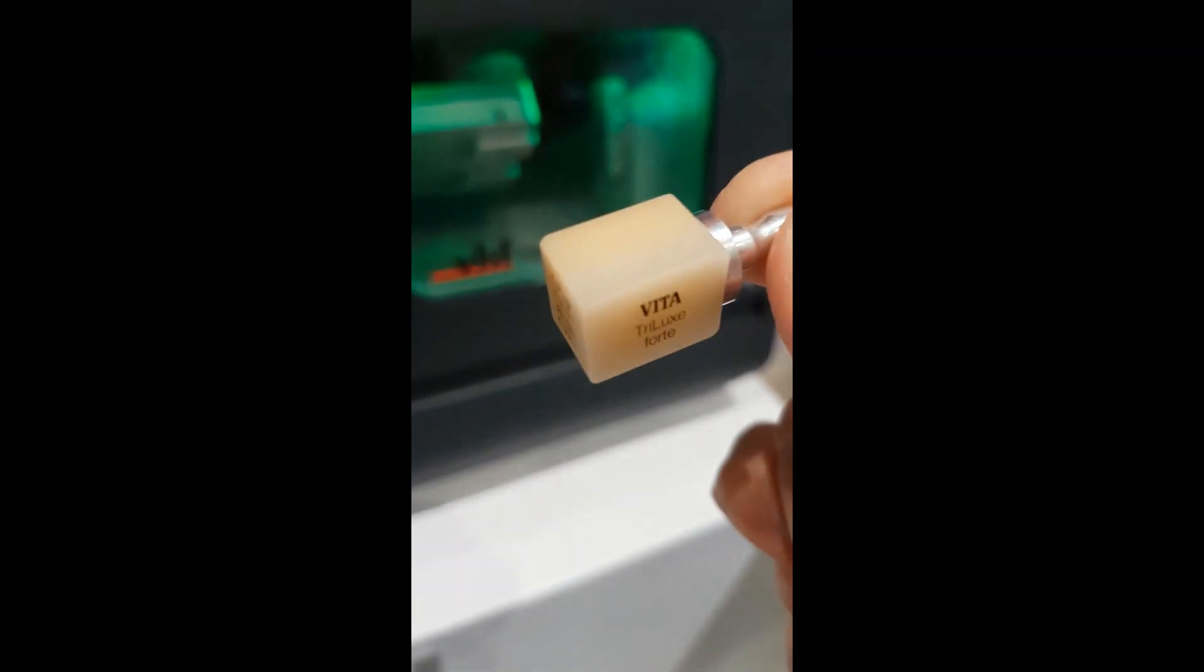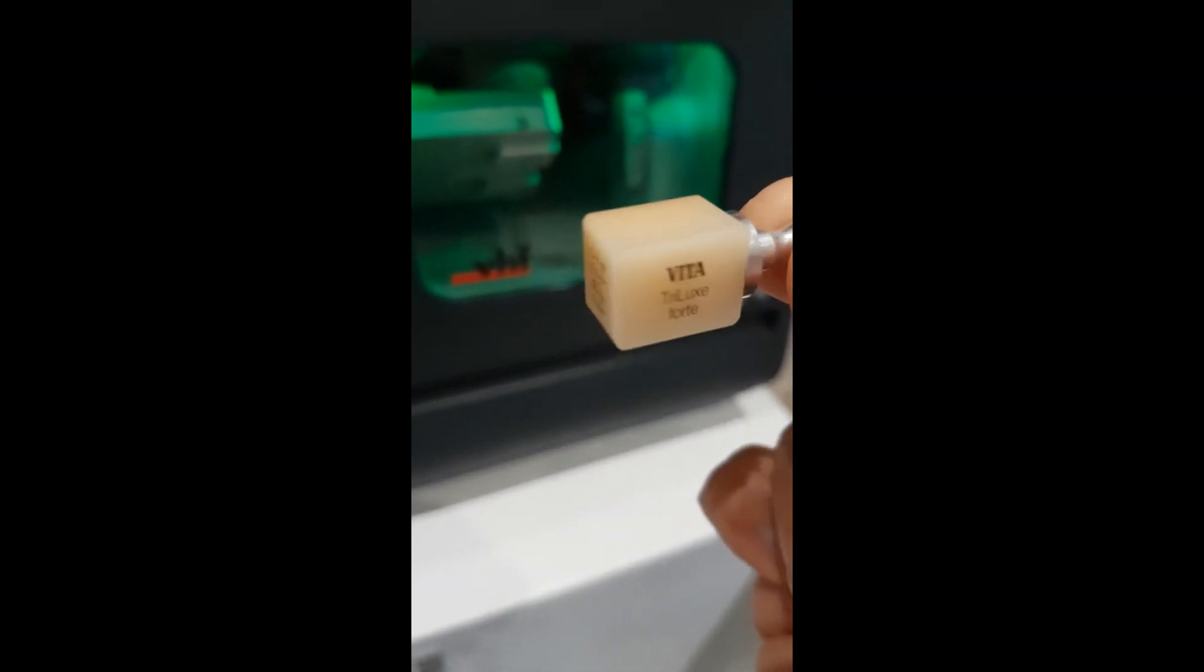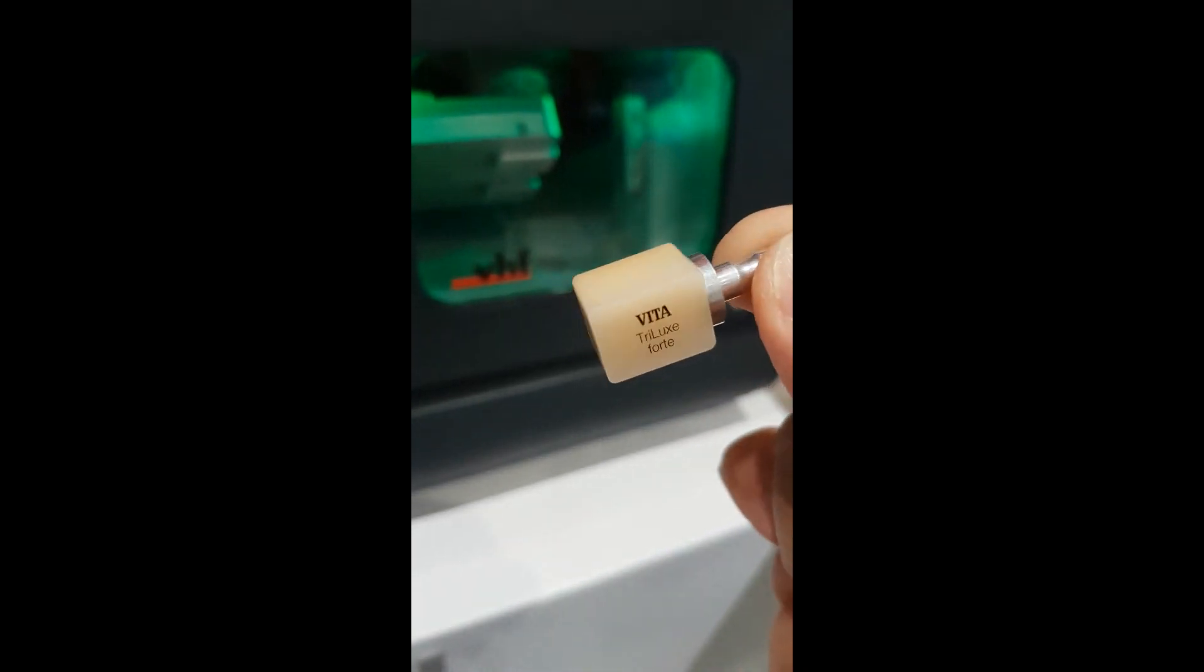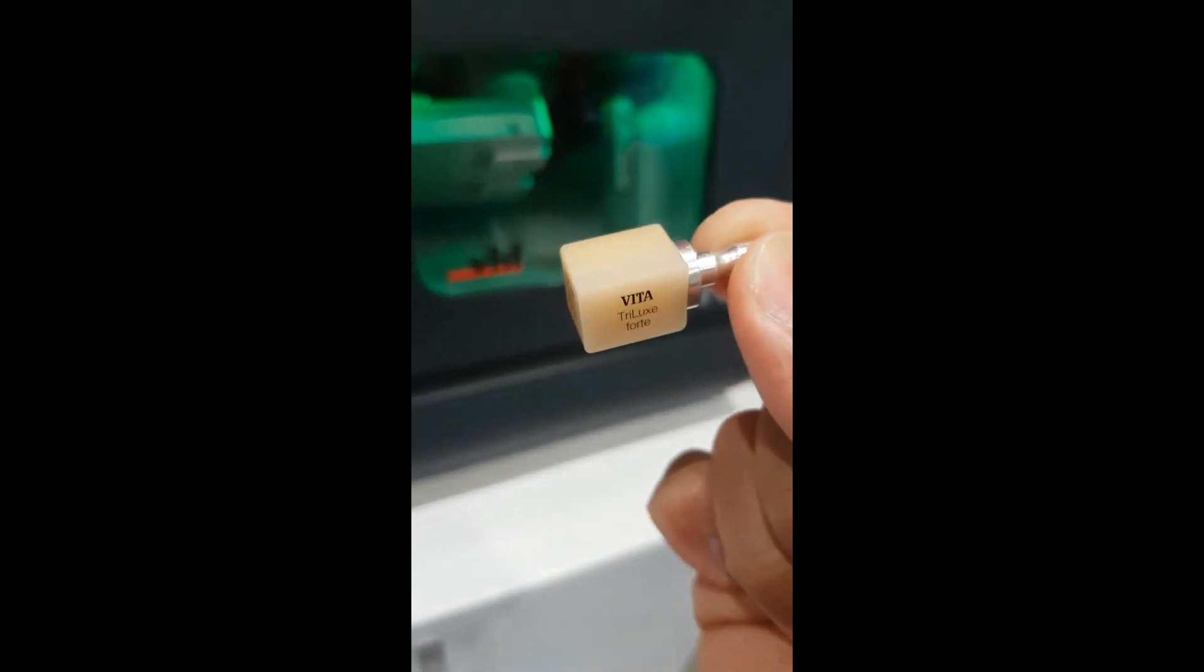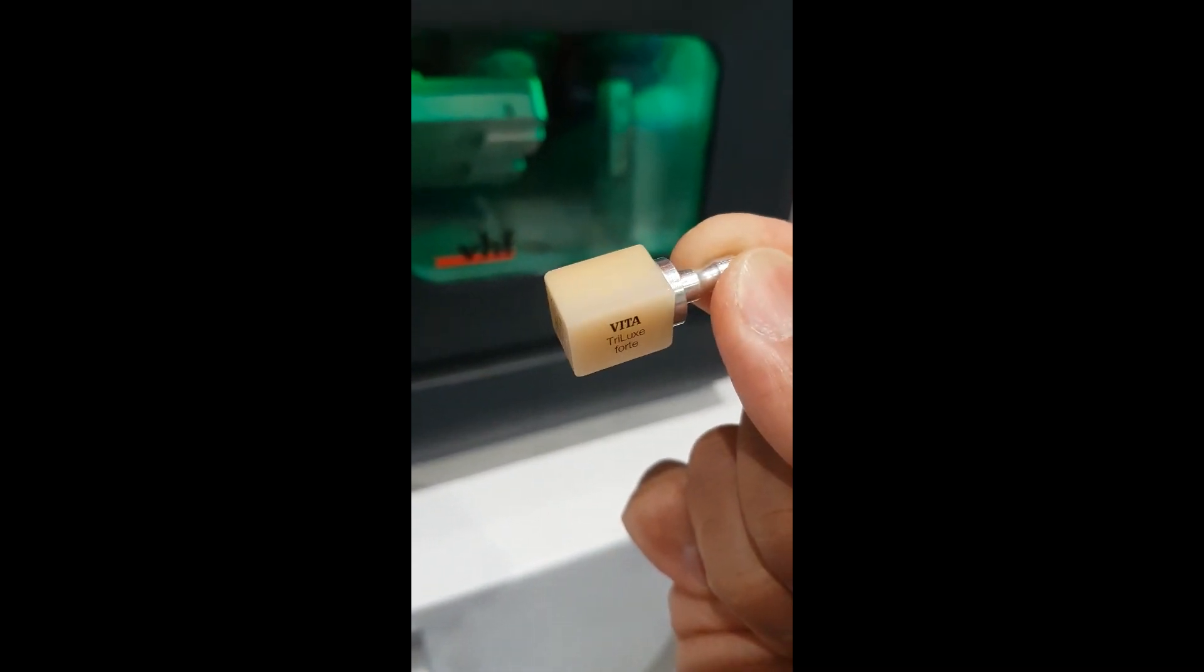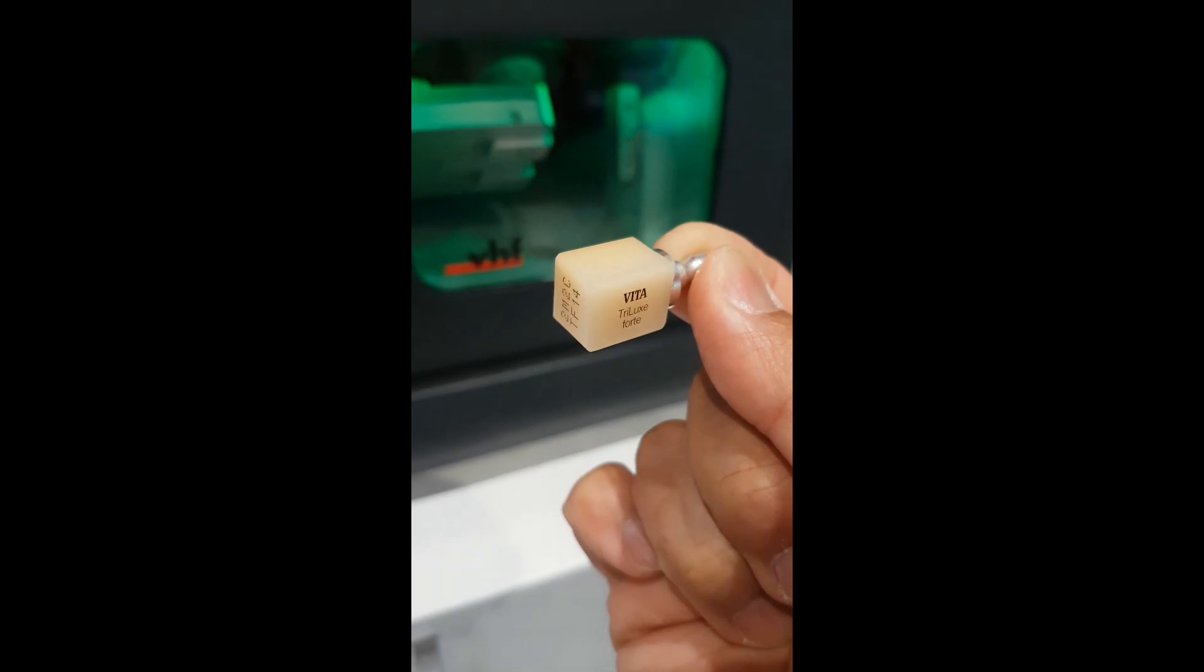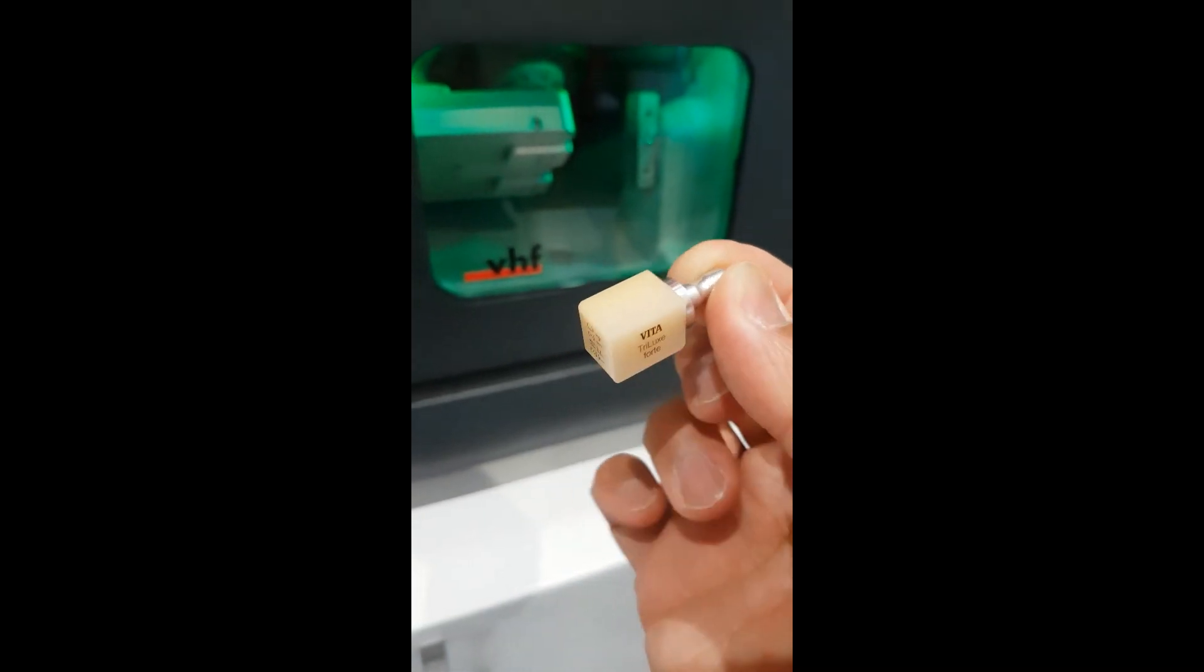Good afternoon everybody. This is a Vita Trilux Forte size 14mm block, and what we're going to do today is mill this into a crown for a lower left seven tooth—a full ceramic crown. I'm going to place it into our VHF milling machine.